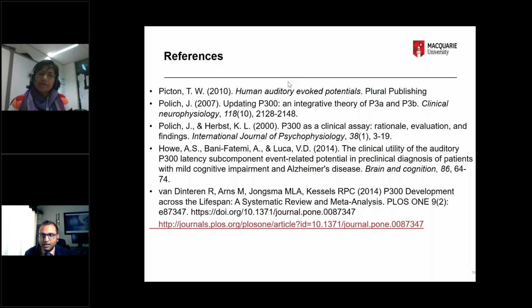And leading on from there, one of the comments is that we do not have a standard test battery for diagnosis of APD. So where we compared the patients where we didn't have APD and we did P300, whether it was a result of faulty APD testing rather than a problem with the P300 diagnosing it. Do you have any thoughts on that?